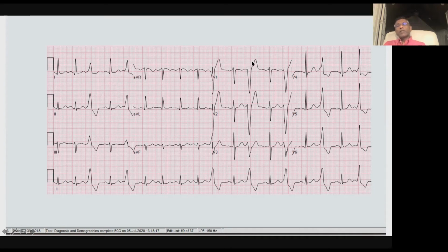When you come here, is this a left bundle type morphology beat or a right bundle type morphology beat? Left bundle. Typical or atypical? It's a bit unfair because it's hard for you to do the measurements off the screen there. But it's a little bit atypical.